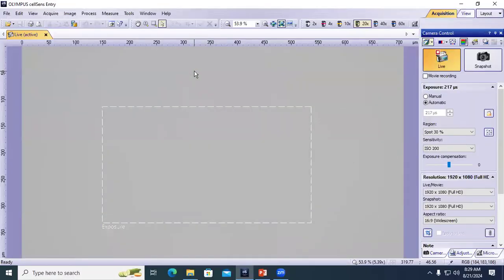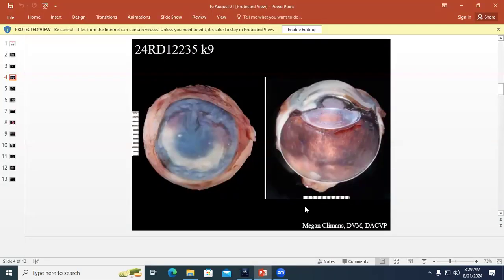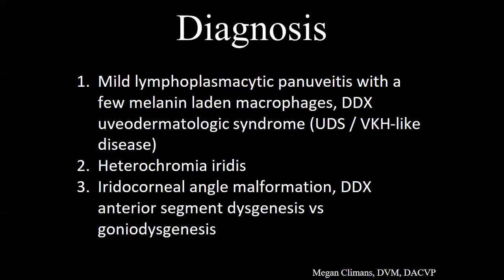Yeah, so regarding that, there's some interesting comments here. Karen Naranjo asked the same thing, if the other eye was affected or not. So there's no history of uveitis in the other eye, right? At least no history of, yep. So at present, it would seem normal. And then Billy said the same thing, that maybe if the other eye is fully blue, not heterochromic, the inflammation might not be as impressive. And it is, which is very interesting. It was funny because you were saying that, and the parallel conversation was happening at the same time with the same conclusions here. So I hope you guys are happy with the answers there.